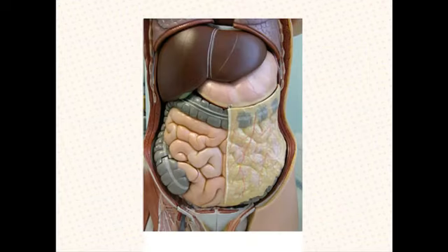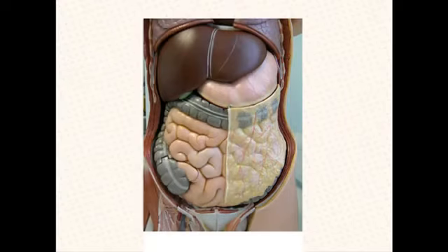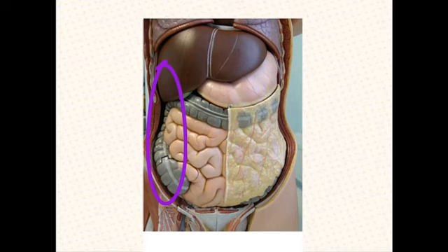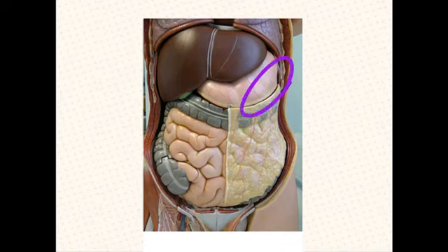Free fluid in the peritoneal cavity will flow throughout the abdomen, preferentially in the relatively unobstructed right and left paracolic gutters. Of these, the right paracolic gutter is deeper and wider, making fluid more likely to flow here, and therefore making the right upper quadrant the most likely location to accumulate blood in acute hemorrhage. In addition, the phrenicocolic ligament blocks some flow to the left upper quadrant, making the accumulation of fluid there slower.